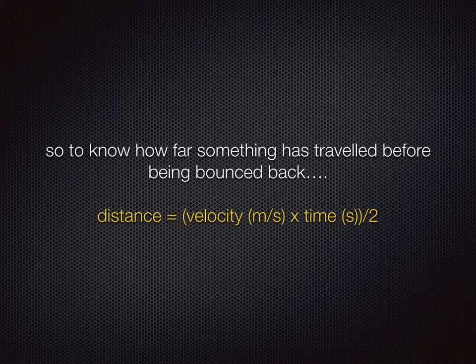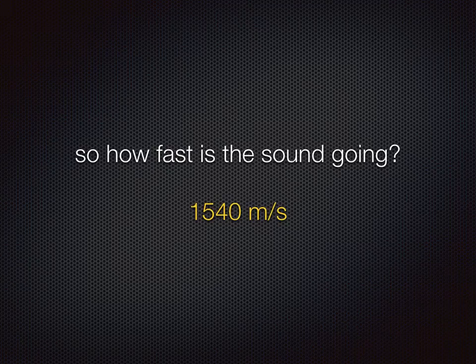Okay, so we can think about balls, but imagine our ball is actually a little pulse of ultrasound. So it's sound waves, not balls, not light, nothing else, just sound waves. In most soft tissues, the ultrasound machine will anticipate that the sound waves are travelling at 1540 meters a second. And this in most tissues is true, apart from in some tissues it'll be slightly slower and some slightly faster.